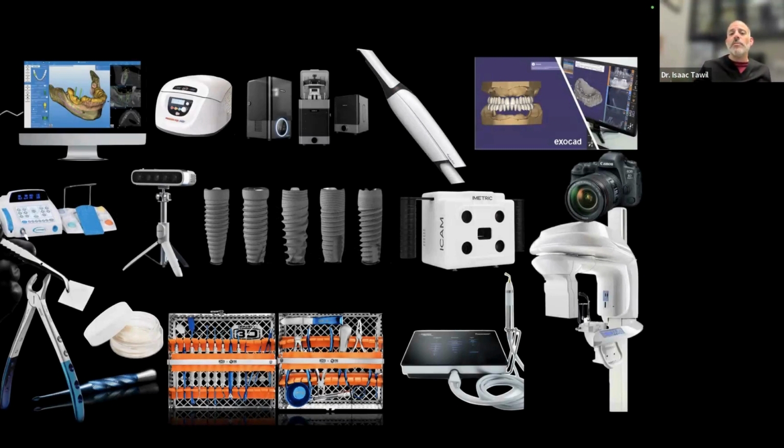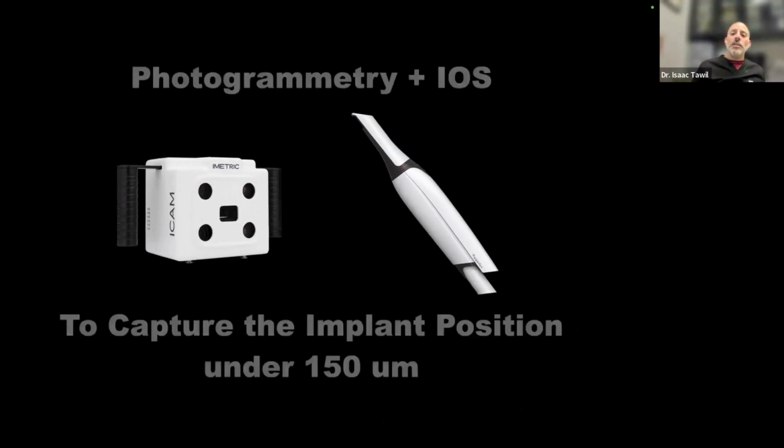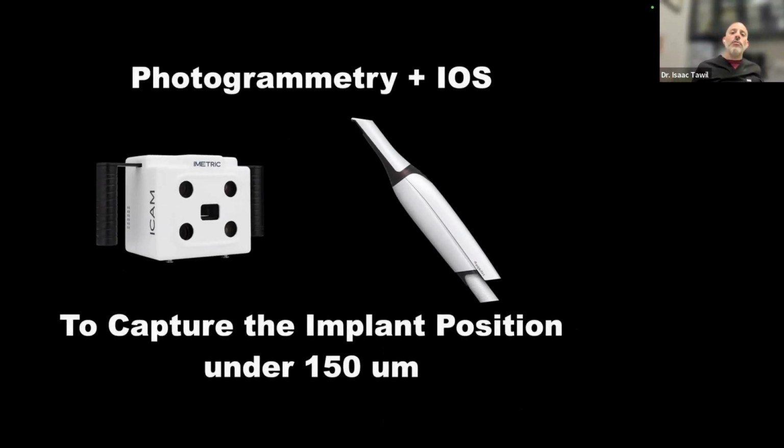But some of the things that I want to be a full arch clinician and do same day surgery revolve around using two specific devices, one intraoral scanner and one photogrammetric capture device. This together in combination will get me below that 150 micron threshold easily, probably put me below 30 microns and give me that extra cushion I need to be able to scan and capture with ease.